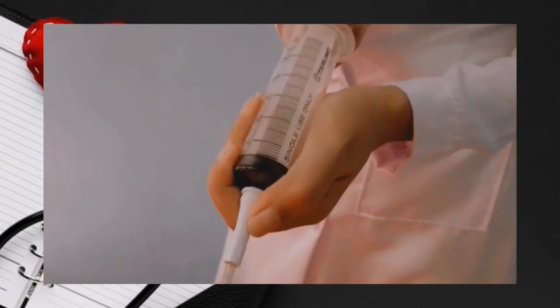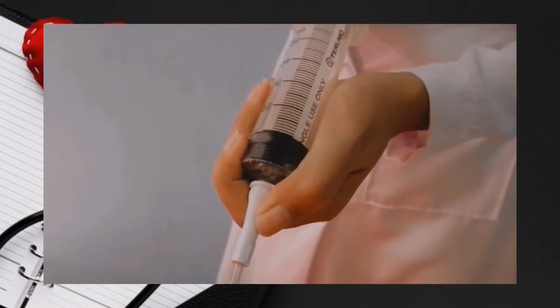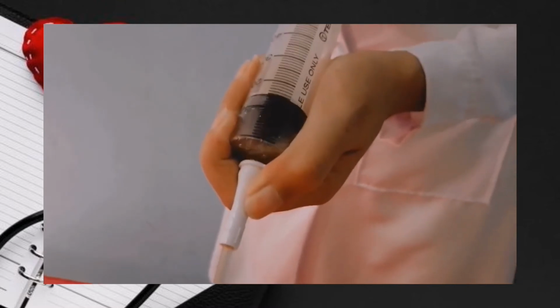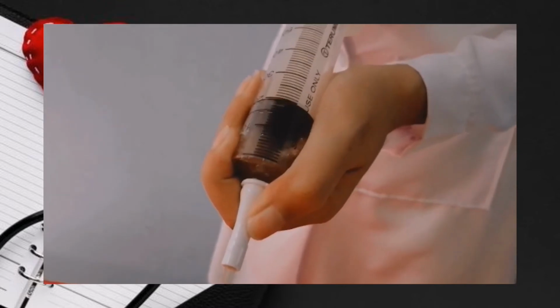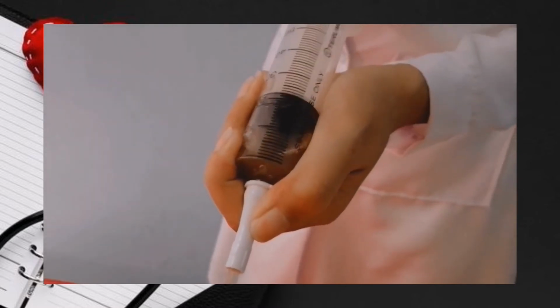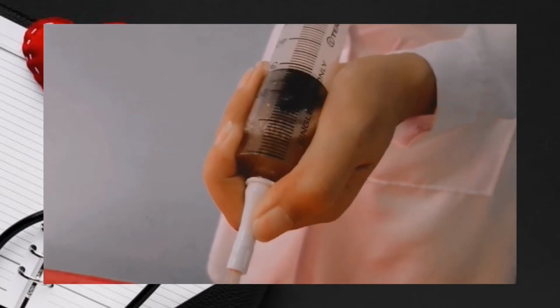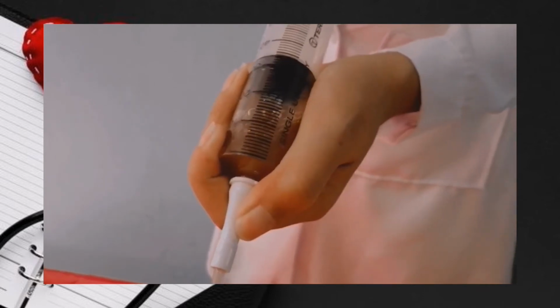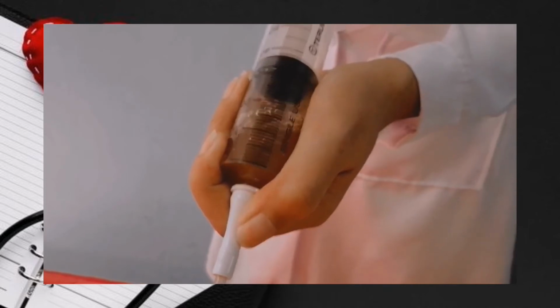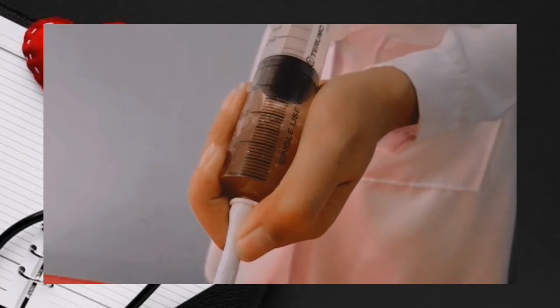The next procedure is to aspirate for stomach contents to verify placement. Reinstill aspirate. If it is greater than 100 ml, delay the feeding for 30 minutes to 1 hour and check again. Auscultate the abdomen for presence of bowel sounds. Notify the physician of high gastric residuals, absence of bowel sounds, or patient's complaints of abdominal discomfort before administering tube feedings. This is to reduce risk of gastric regurgitation.